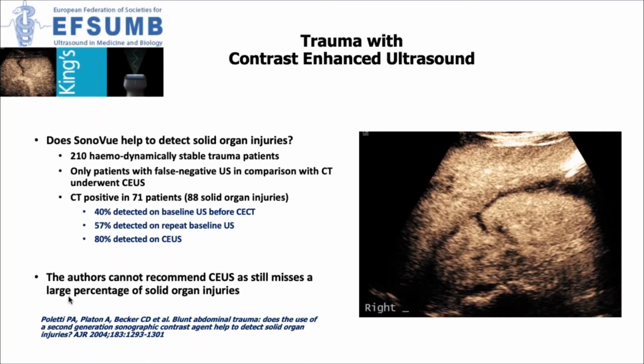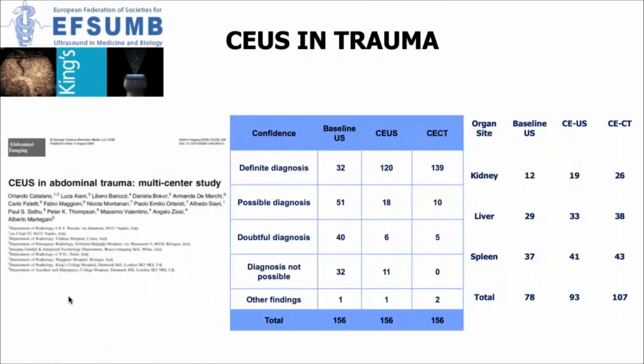But the conclusion is perhaps somewhat paradoxical. What the authors have suggested is that it's insufficient as a modality, contrast enhanced ultrasound, that actually there's still 1/5 of traumas that are not being picked up, 1/5 of solid organ injuries that are not being picked up.